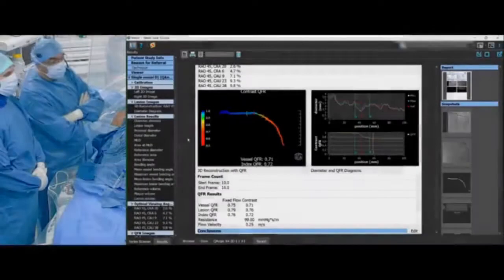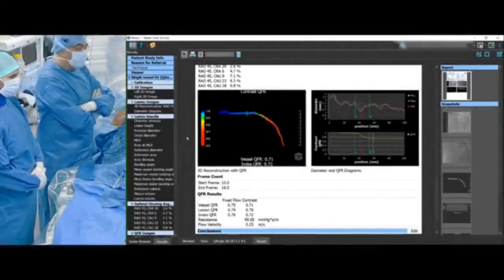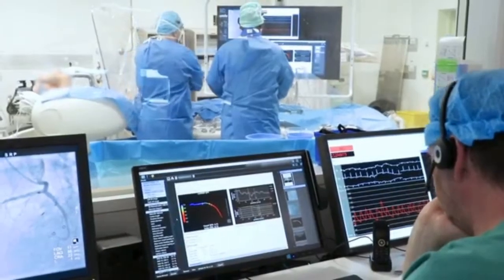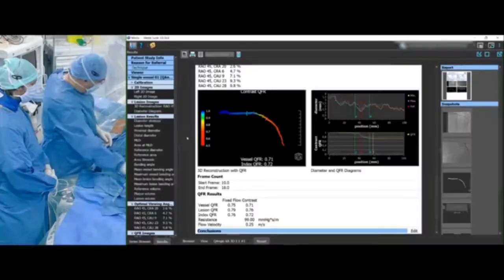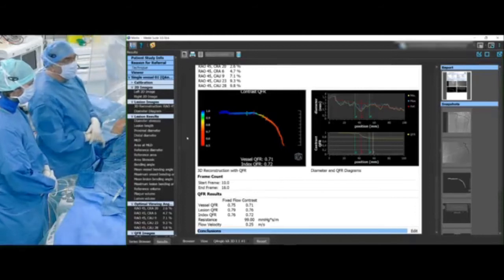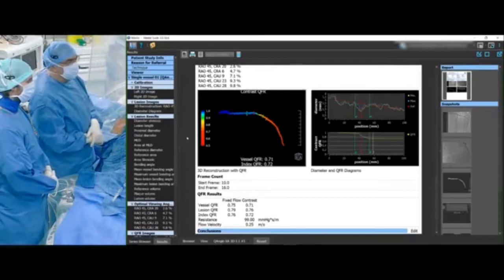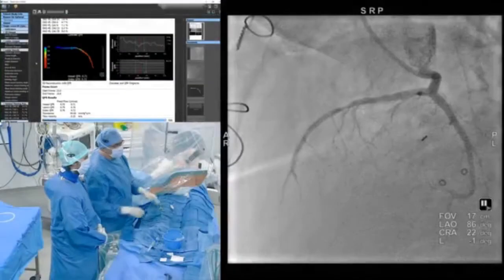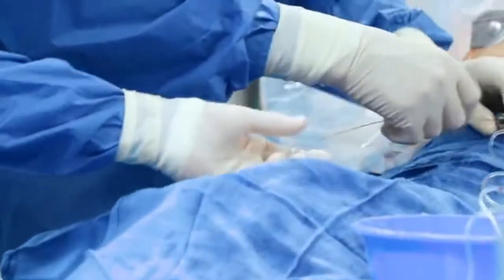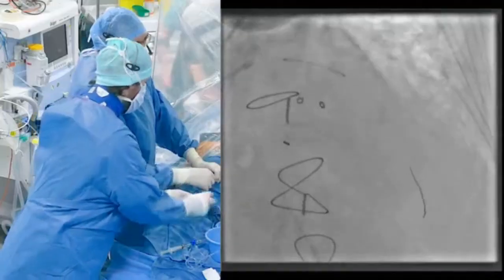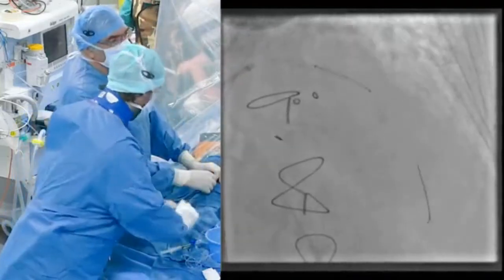This is a significant lesion both angiographically and hemodynamically. What we will do now is to place a stent by direct stenting. Concerning the size of the stent, we have the possibility to use a 2.5 mm stent followed by post-dilatation around 2.8 mm. We advance the 28 mm stent with the goal to cover the proximal plaque and the most critical lesion.